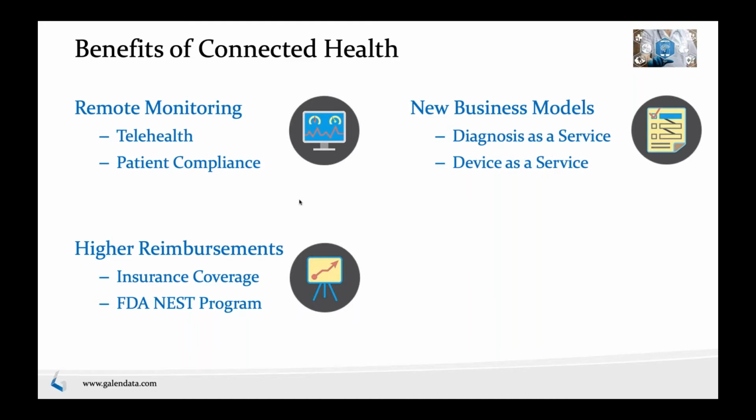Also, there's a different business model that's going more and more mainstream, which is device as a service. Traditionally, devices are sold to healthcare systems, some of them at a very high price point, and it's not always an easy sale. In this model, instead of selling the device, you're leasing the device and charging them per use, similar to how you often use software these days.